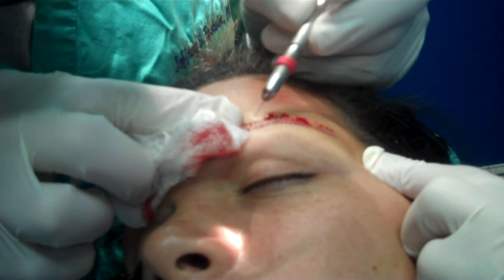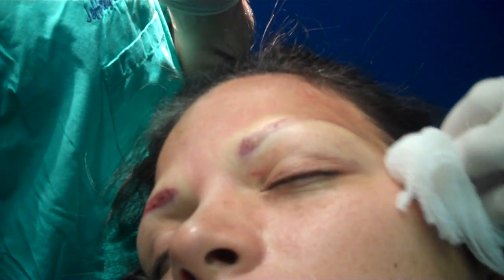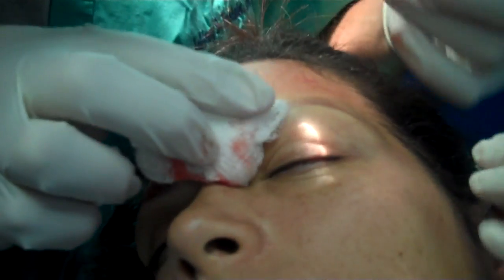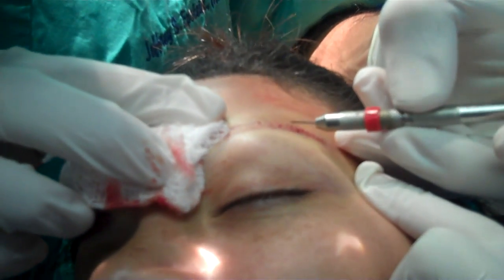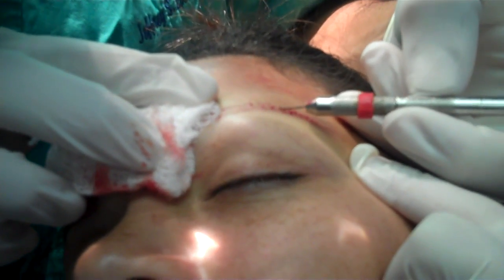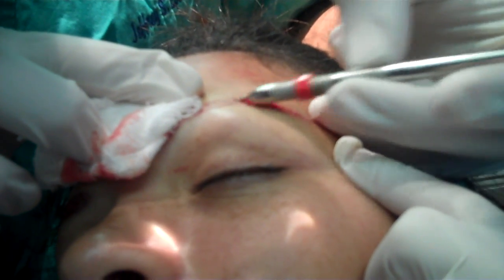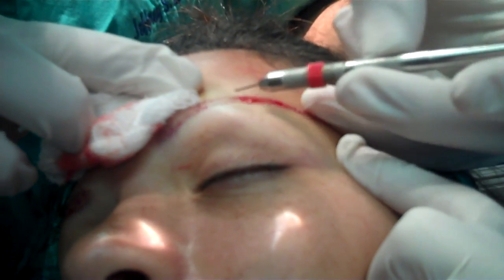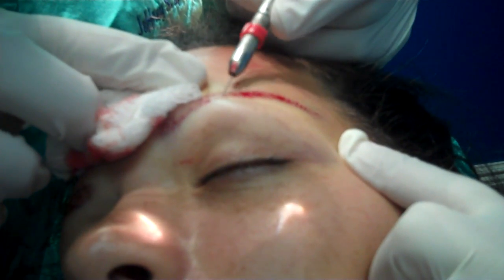With these small blades, I'm able to work in between each prior recipient site. Now I'm using a 0.6 mm recipient site, because this is where the slightly larger two-hair grafts are going to go. And once again, I'm reinforcing that crosshatch pattern — these superior hairs are going downwards, and these inferior hairs are going to go upwards.